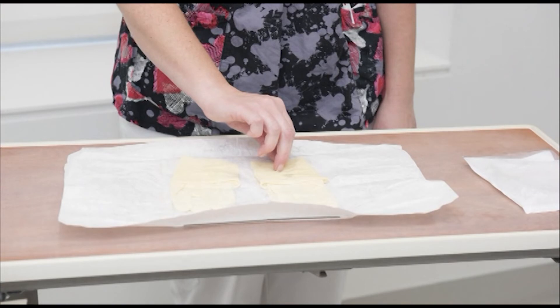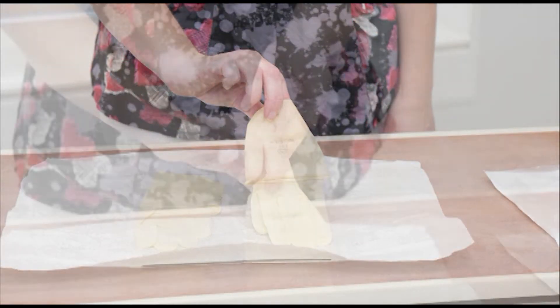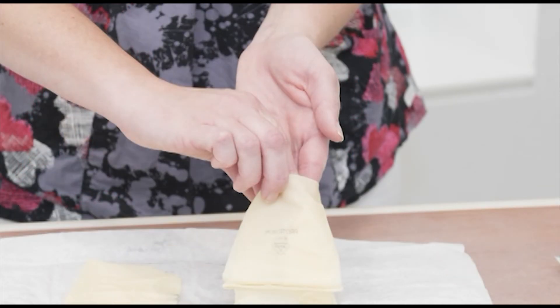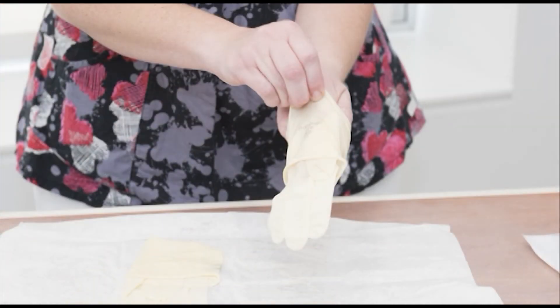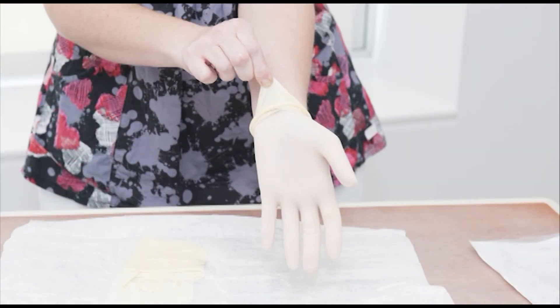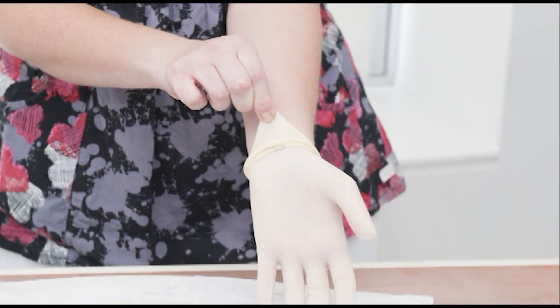With the hand that you usually write with, grasp the opposite glove at the folded edge of the cuff. Pick up the glove by the folded edge and slip your hand into the glove. Keep your hand flat and your thumb tucked in, then pull the glove on. Be careful not to touch the outside of the glove — touch only the part of the glove that will be next to your skin. Leave the cuff on the glove folded.